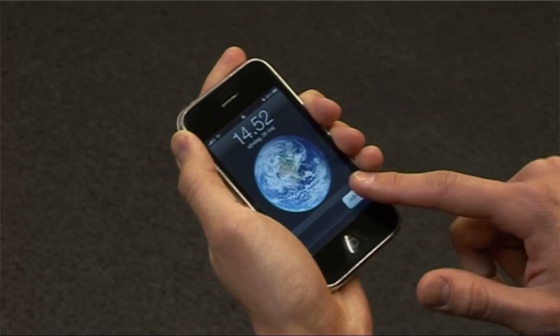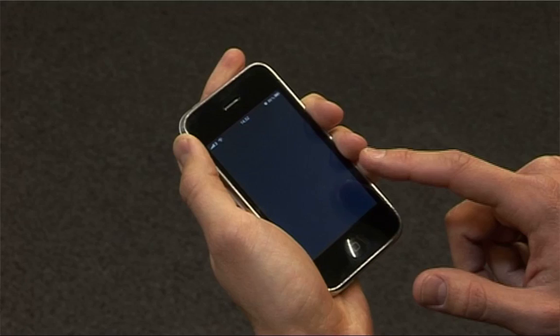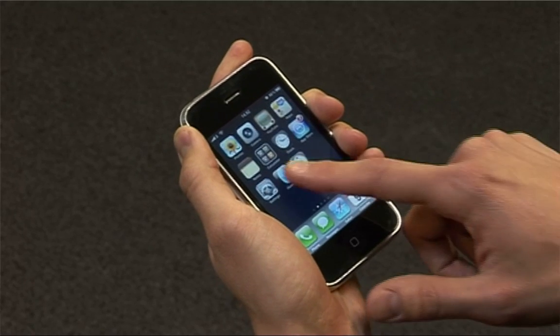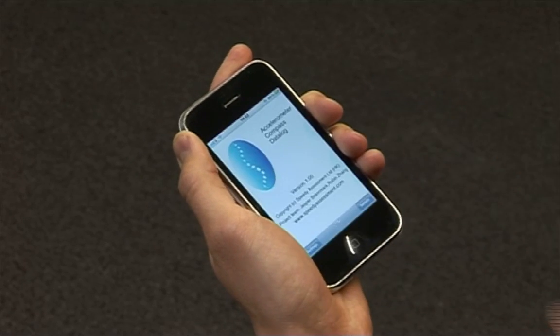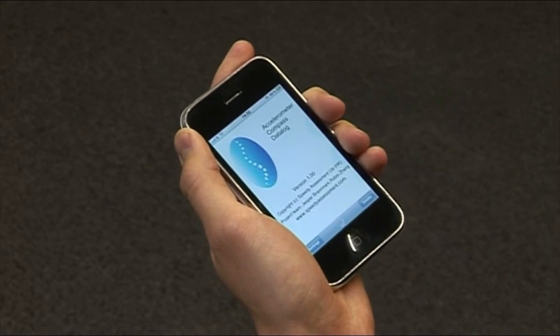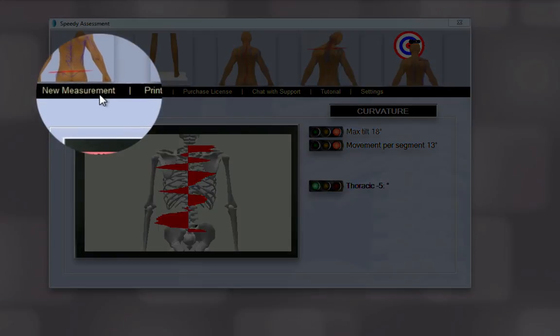Start the eye sensor application and click on New Measurement.